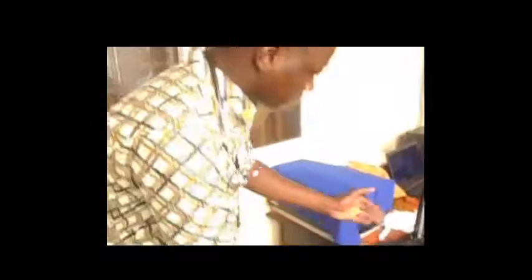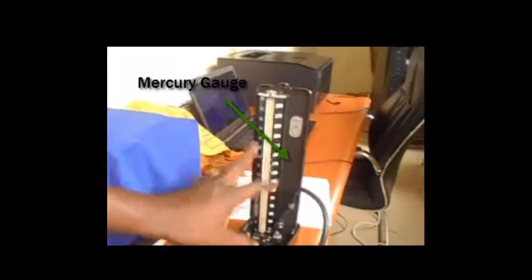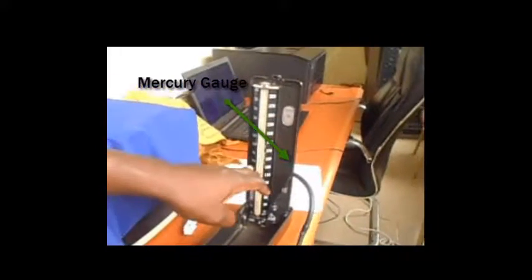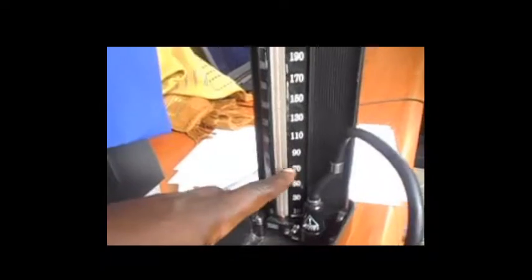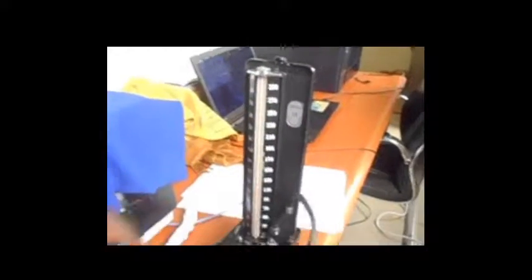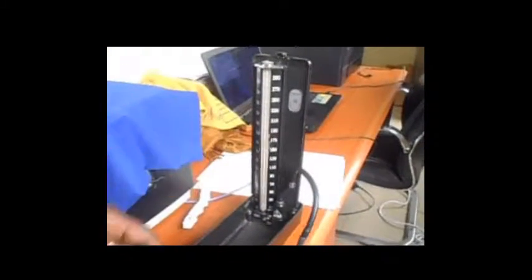Let's look at the mercury gauge. This aspect is called the mercury gauge. You can see it comes with some calibrations: 10, 20, 30, 40, 50, 60, 70, 80, up to 300. They all represent measurements that are to be taken.